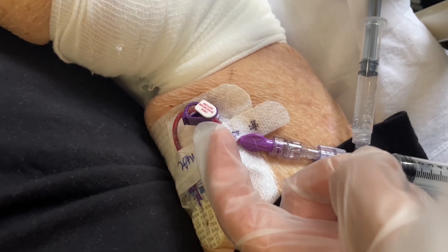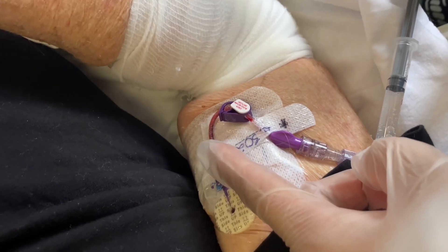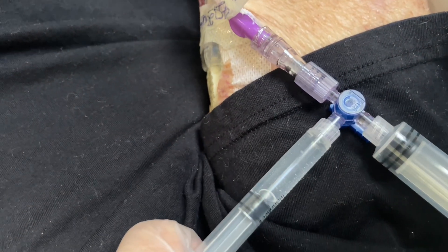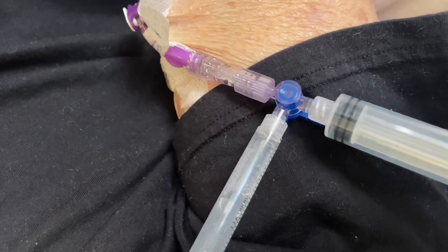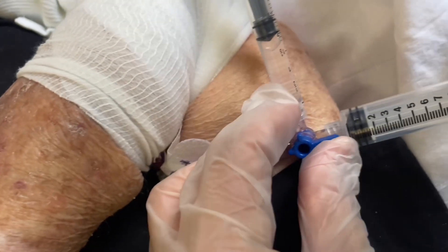Give it time to erode some of the fibrin development. What I like to do is have the plunger standing upright so that when I suck in — there was a little bit of an air bubble that came from here. We're going to try that again, give me one second.